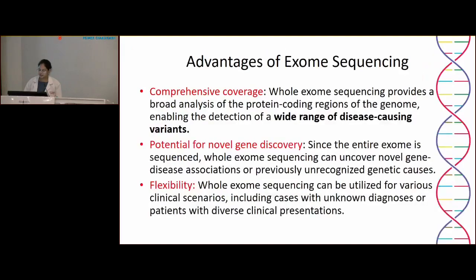The advantages of exome sequencing are that it gives you comprehensive coverage for a wide range of disease-causing variants. It has potential for novel gene discovery, and it has flexibility in that it can be utilized for various clinical scenarios as well as for reverse phenotyping.